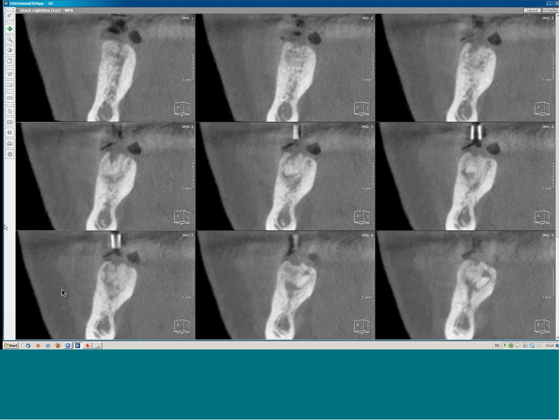And here, once again, you see this kind of material which was brought in here as well, and here as well. So this is all material, this is no root rest, and you can see it could be very critical to figure out if it is a bone, if it is a root rest or not.